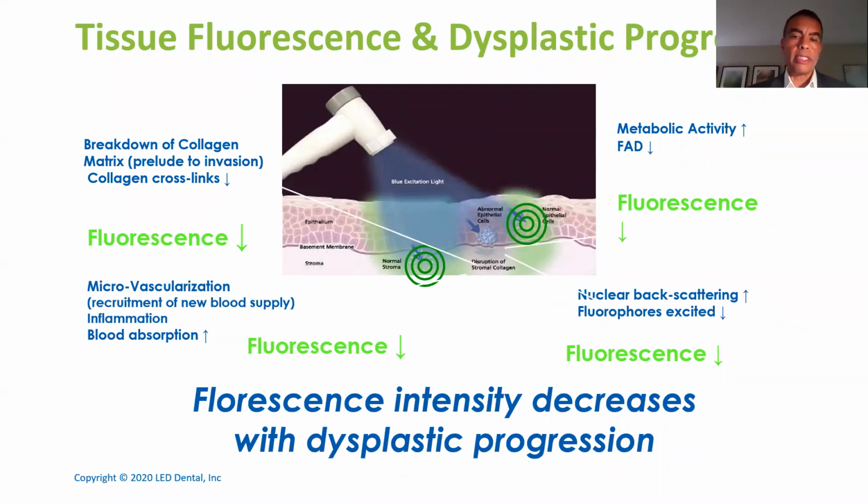Ms. Smith, this is completely safe. There's no radiation. There's nothing that's going to cause damage to cells. It's painless. It's fast. All we're using is a safe blue light that has a certain intensity that allows us to get below the surface and identify if the tissue is normal or abnormal. And you can say it, it's really that simple.